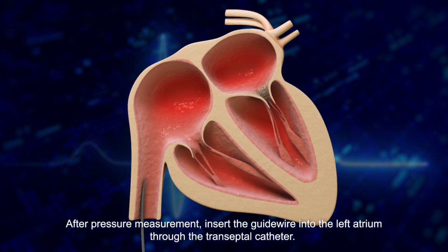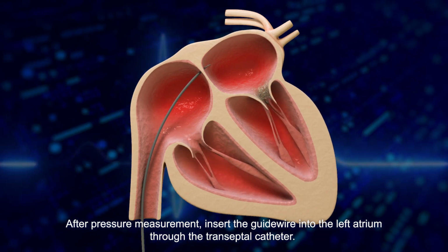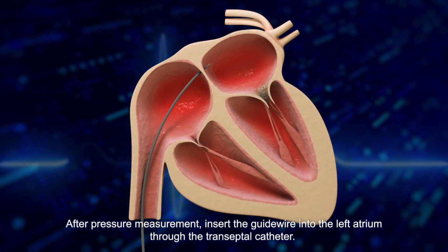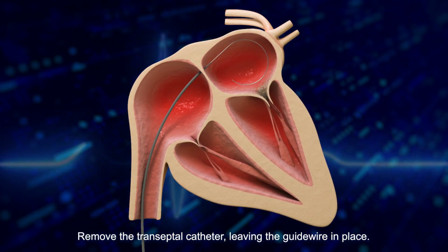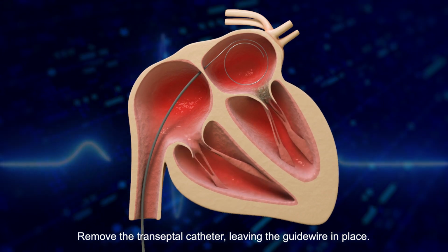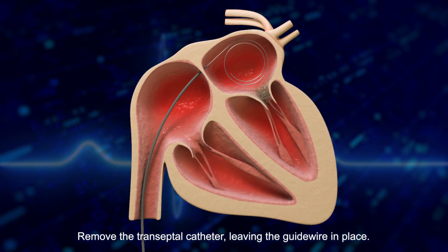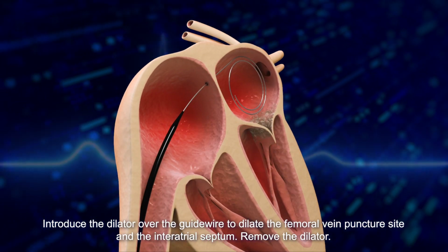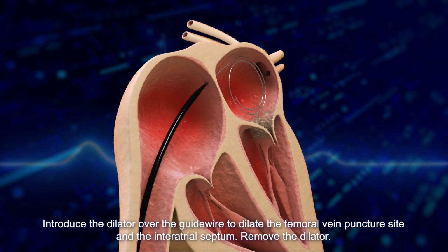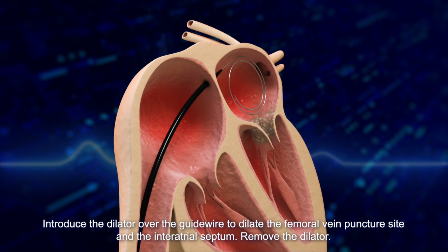After pressure measurement, insert the guidewire into the left atrium through the transseptal catheter. Remove the transseptal catheter, leaving the guidewire in place. Introduce the dilator over the guidewire to dilate the femoral vein puncture site and the interatrial septum. Remove the dilator.